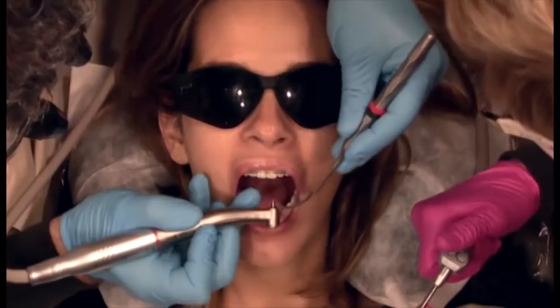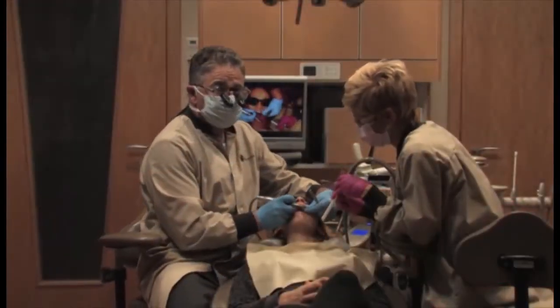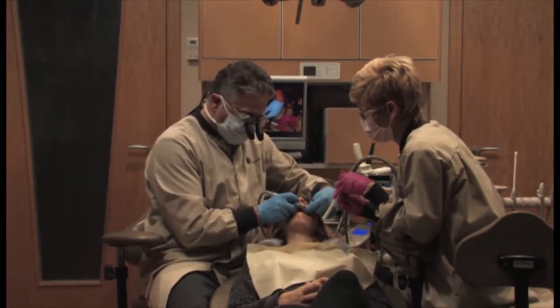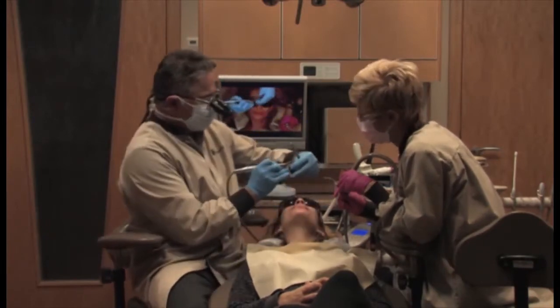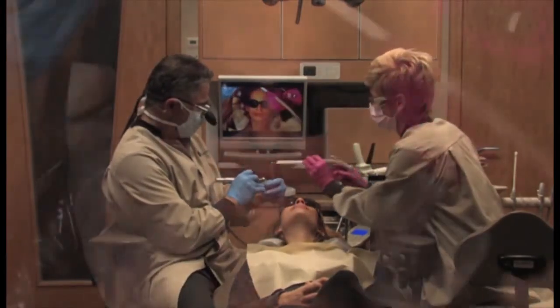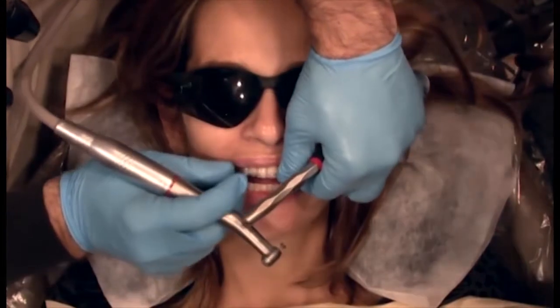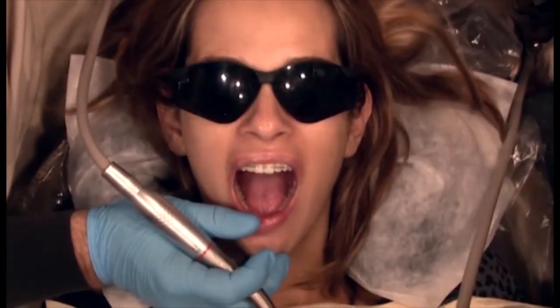I see the red spot. It's moving closer to the front, and because it's moving closer to the front, I'm concerned that I'll hit the back of her front teeth as I reduce the platform. So I'm actually going to take the deprogrammer out and reduce the platform in my hand. So I'm going to come a little over to the side. It's good. We'll come back and place the deprogrammer back in the mouth. Now we'll go ahead and see where the spot is.